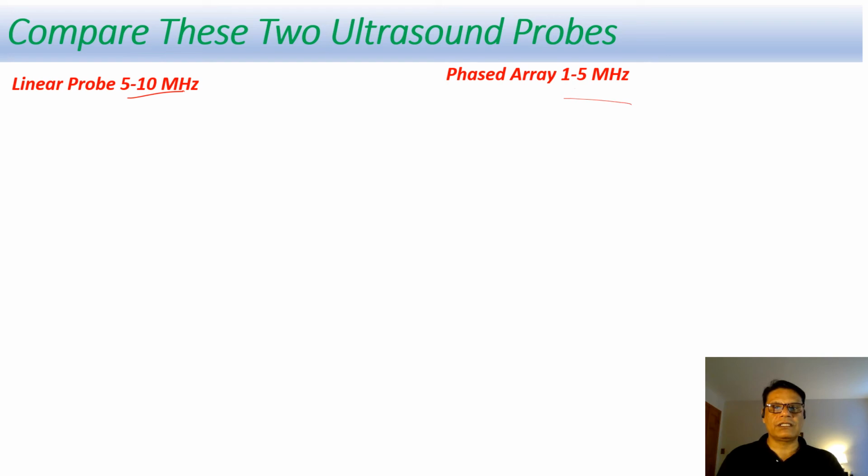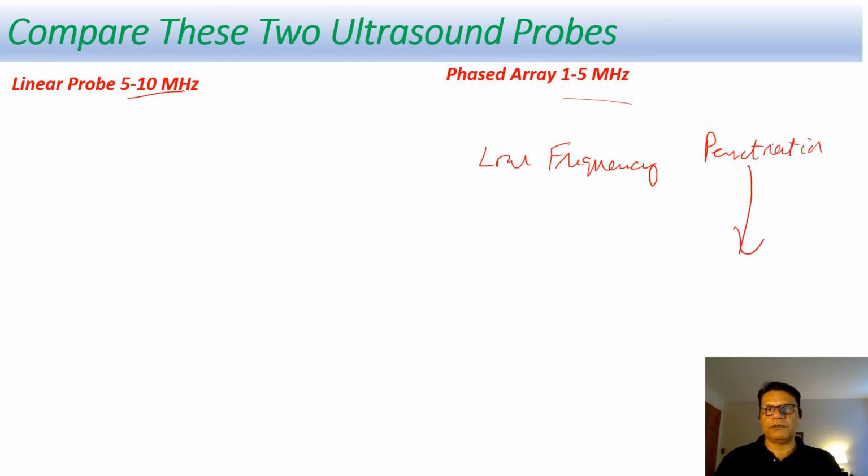This is a low frequency probe. Low frequency means deep penetration, but resolution is decreased as compared to the linear one.